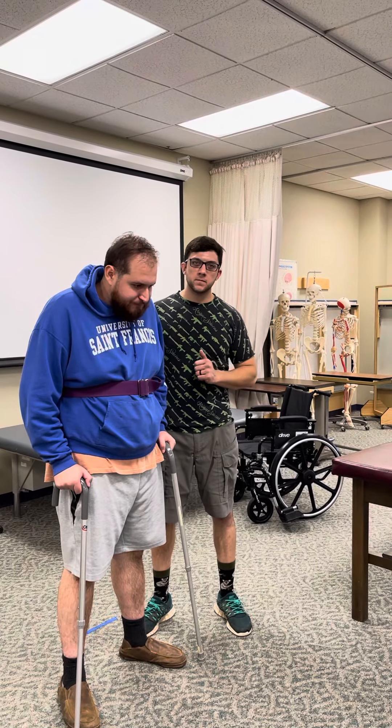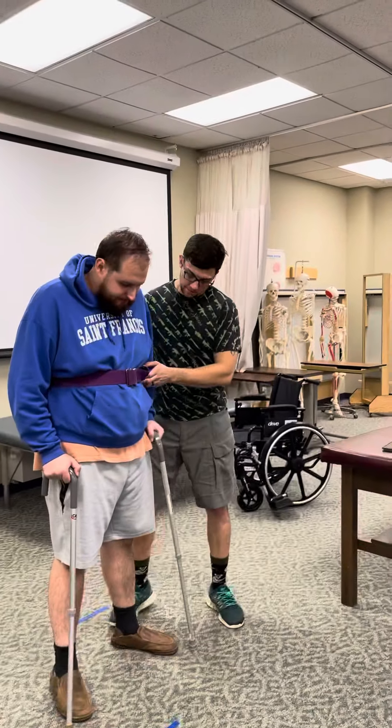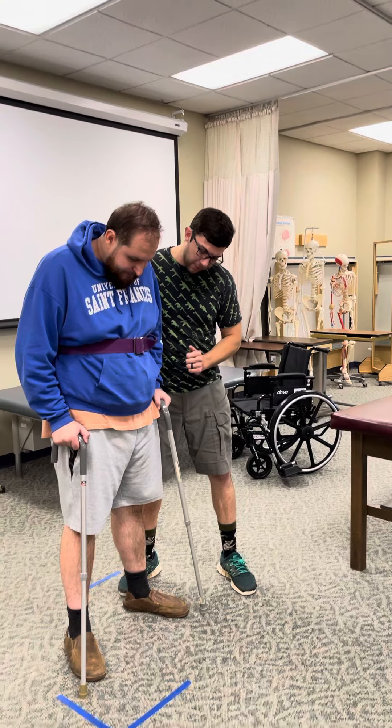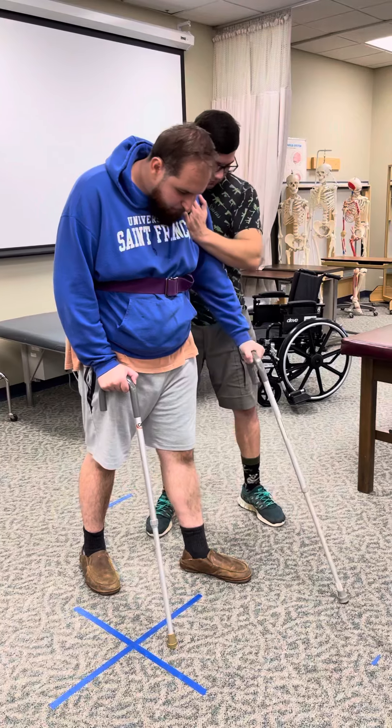Now we have a four-point gait pattern with two assistive devices. We'll go ahead and have you go device first and then opposite foot. So right device, left foot. Left device, right foot.